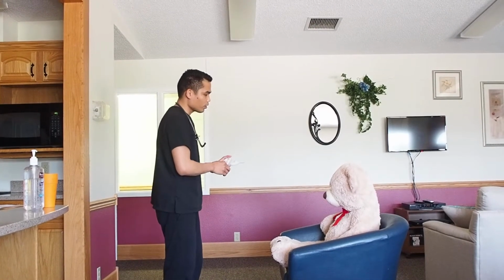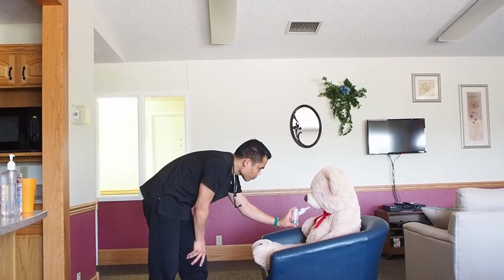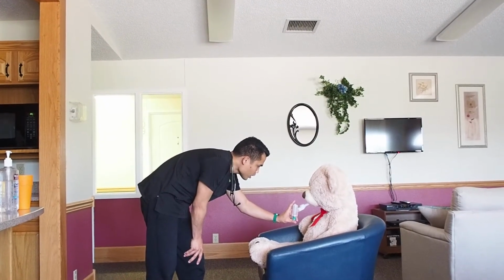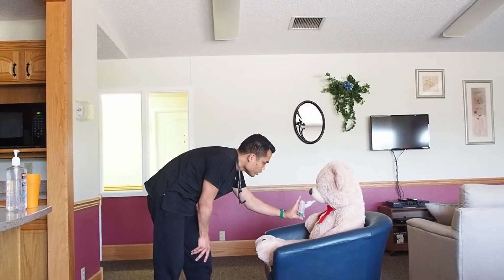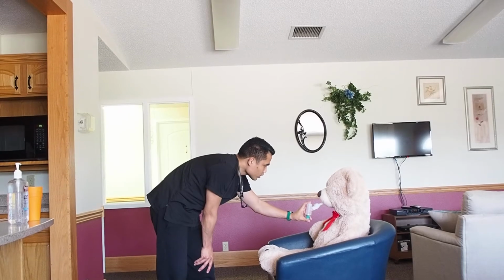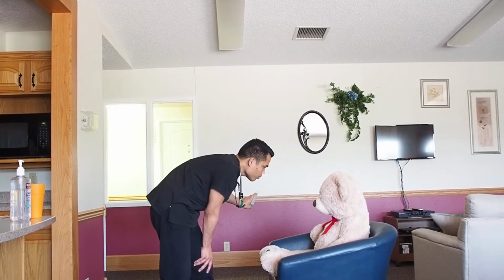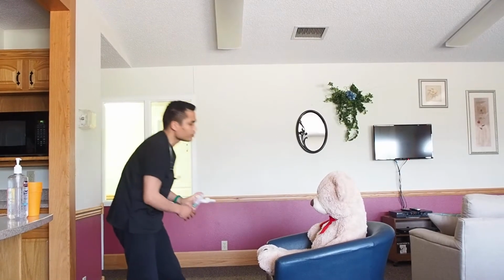Okay, so I think we're ready to go already. So I'm going to put it inside your mouth. Then I'm going to count 1, 2, 3, and inhale deep. Hold your breath. Hold your breath. Hold your breath. And remove the device away from you and exhale. Okay.